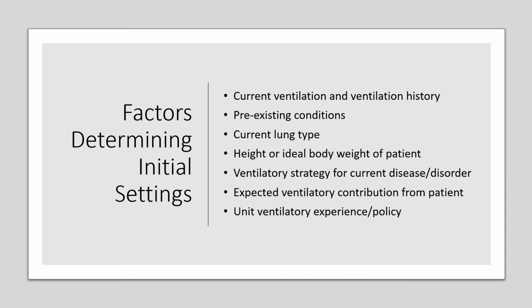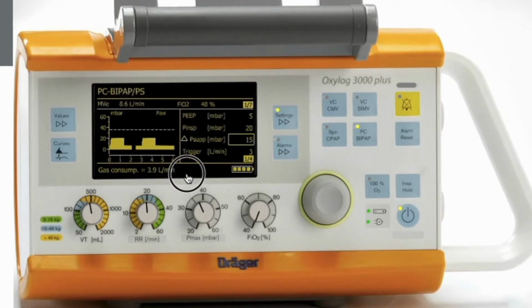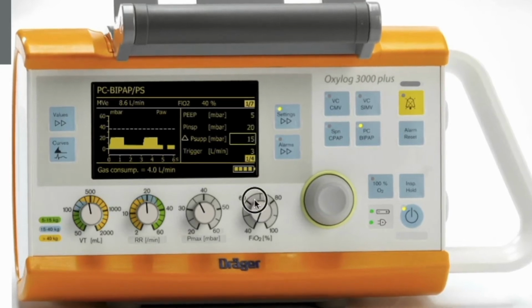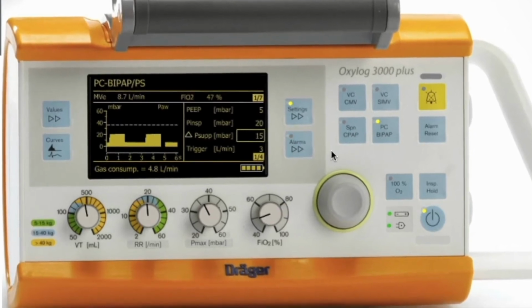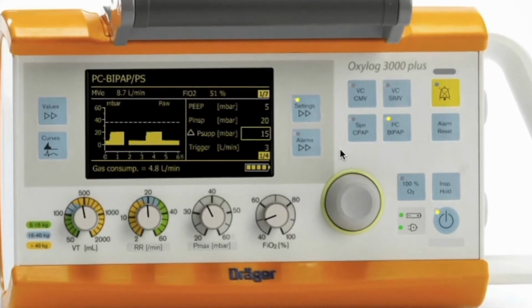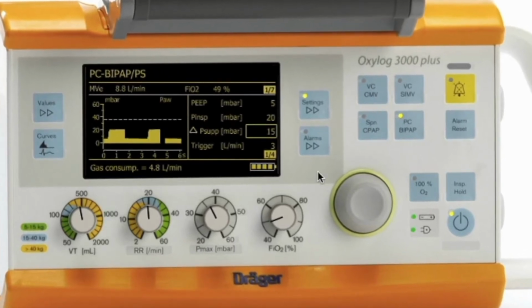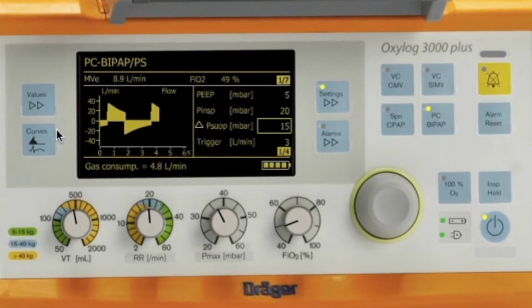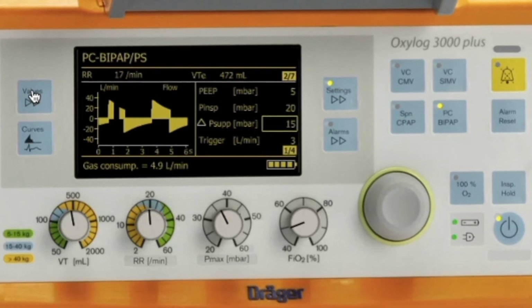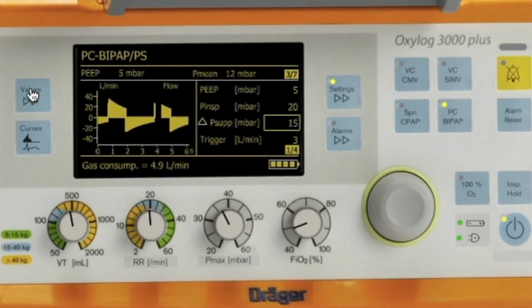They'll also tell you how the patient's ventilating now. They'll tell you what their settings are. And there's no reason why you can't start with those settings, but the thing to remember is these patients will either be handbagged up to the unit or will be on a transport ventilator, and the ventilators on the unit are nicer and better at ventilating patients than the transport vents are. And as such, the settings that they come on with on the transport vent, usually you can lower those when you go onto the conventional ventilator. So it would be good practice to start with what the preceding team were using, but expect to lower them quite quickly.